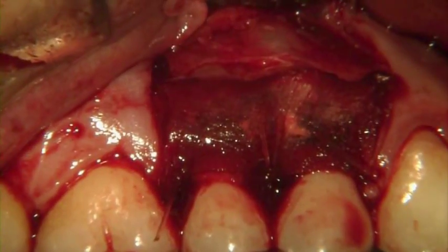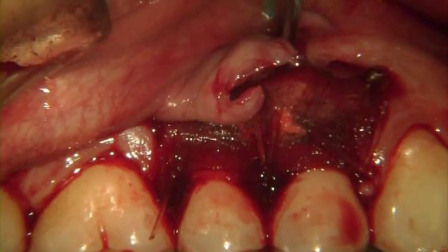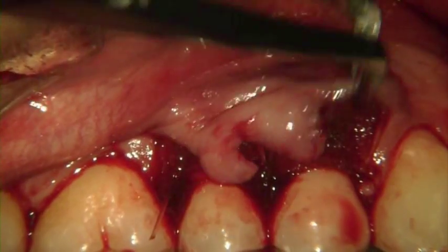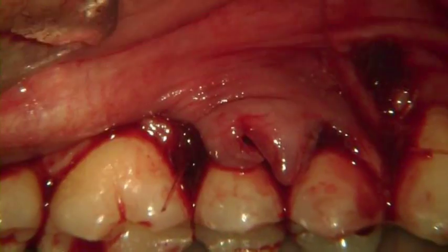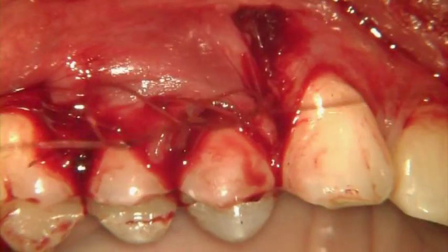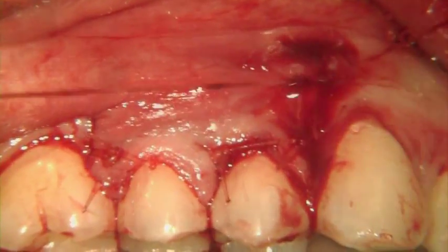Having stabilized the Mucograft three-dimensional collagen matrix, the soft tissue flap is passively coronally advanced to the level of the CEJ or beyond, effectively creating a new gingival margin. Resorbable sutures are carefully placed at each papilla area in order to initially stabilize the flap into its properly advanced position. Each vertical releasing incision is then sutured.